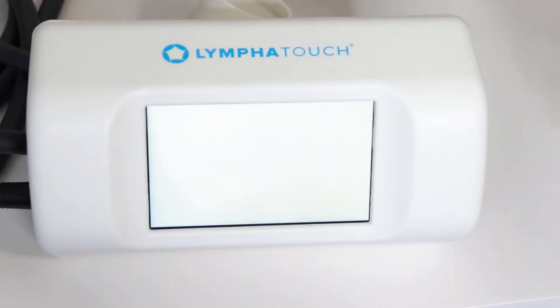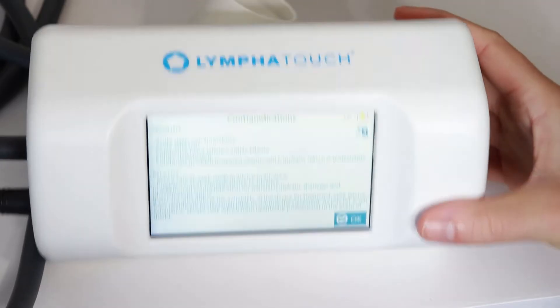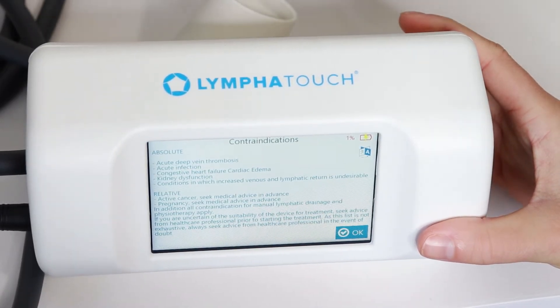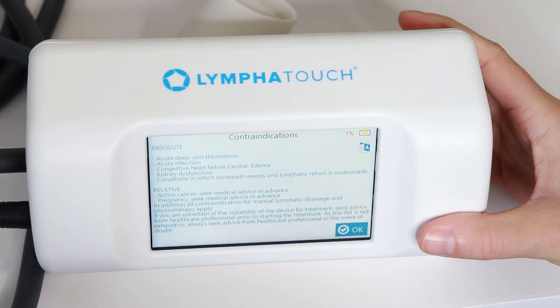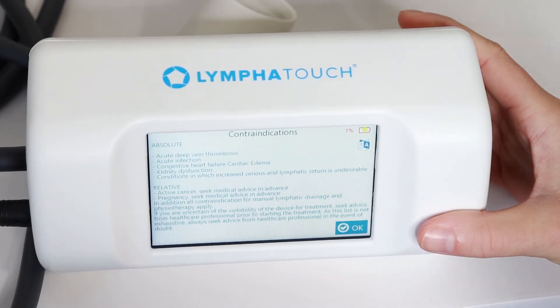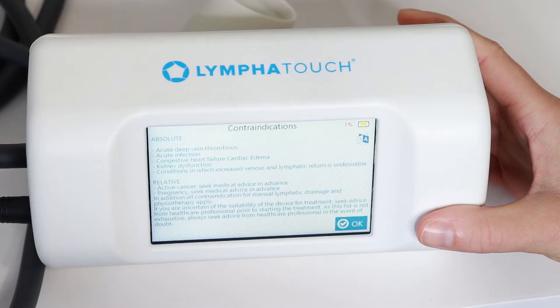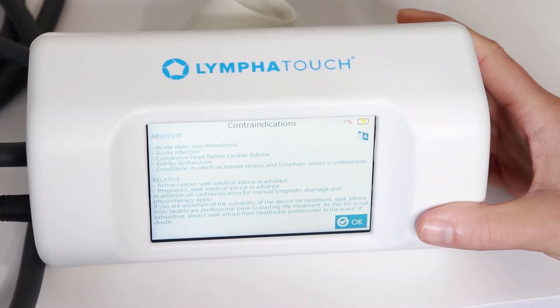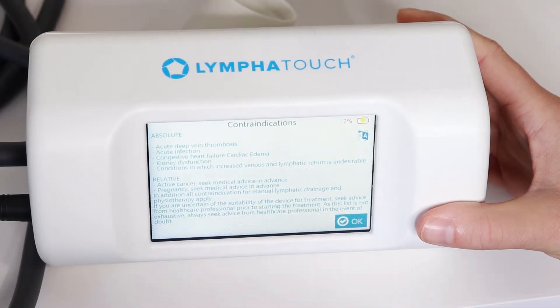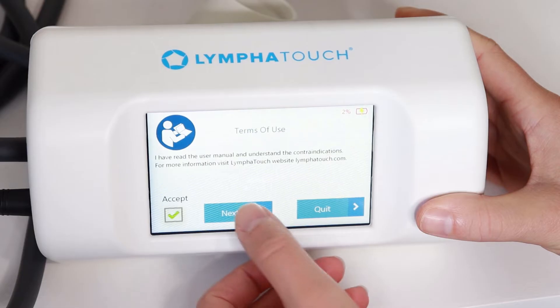If we turn the LymphoTouch on, it will take a minute to load. When we get to the first page, it's going to say contraindications — it talks about when it is unsafe to use this tool. The absolute contraindications, meaning we do not use this at all, include blood clot, acute infection such as cellulitis, congestive heart failure, kidney dysfunction, or other conditions where increasing venous and lymphatic return is undesirable or unsafe. Relative contraindications are active cancer and pregnancy. All of these require clearance before use.